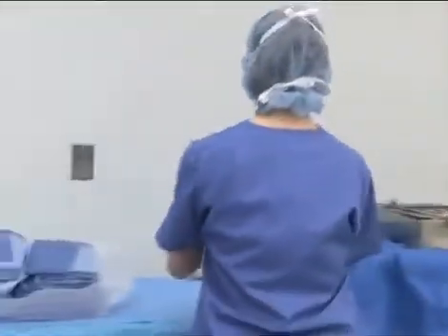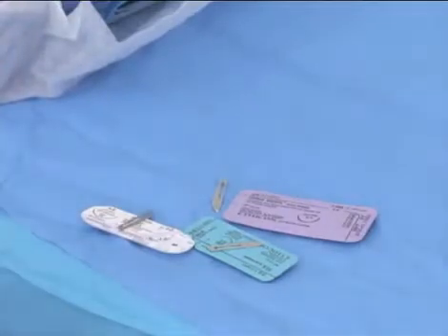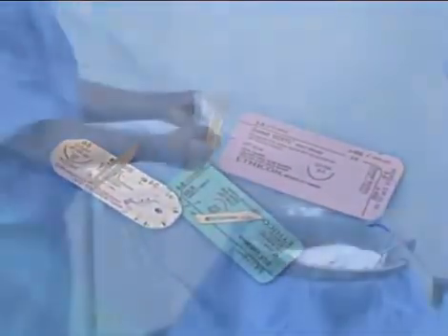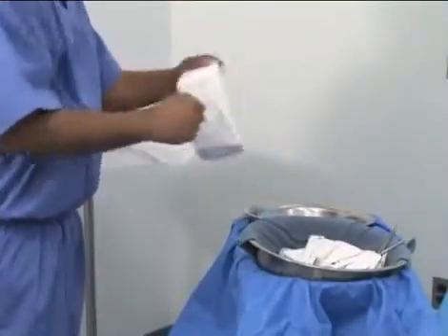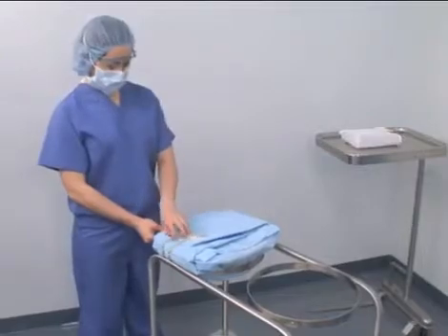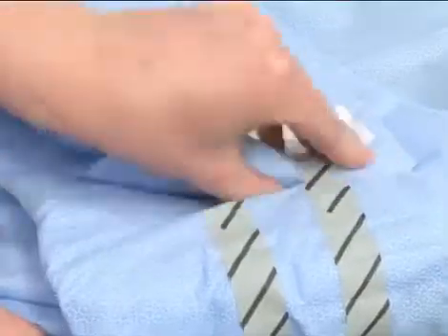Ideally, counted items, such as sharps, should be opened on the corner of the field together. Heavier items should be opened in the basins. Wrapped basins are opened in the ring stand.